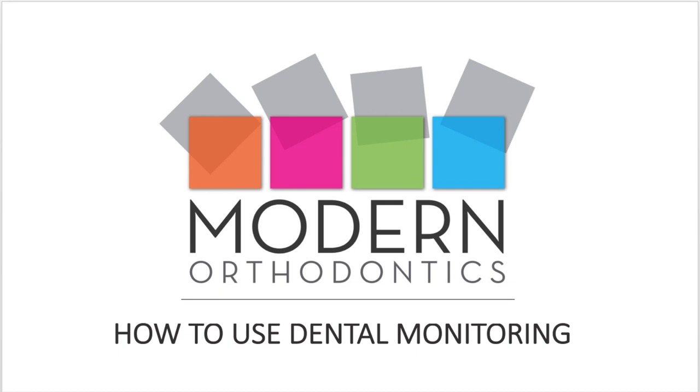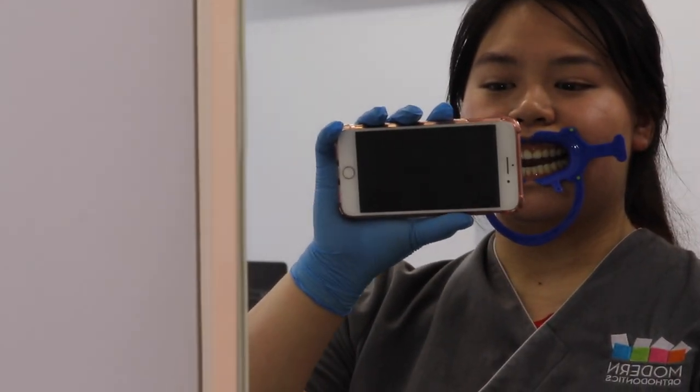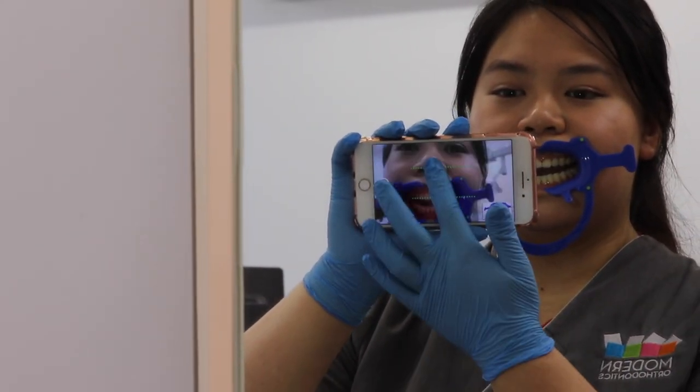How to use dental monitoring. Before beginning, we suggest you take the scan in front of a mirror, as you can only use the back camera when taking a scan.